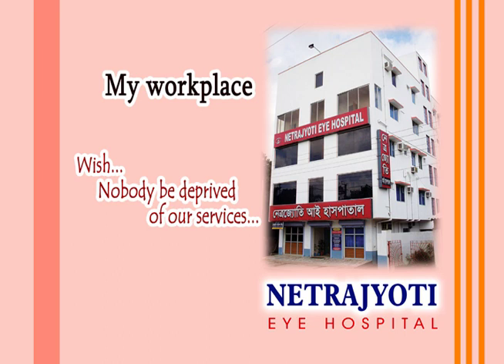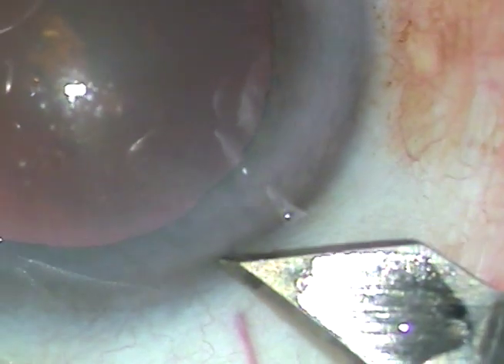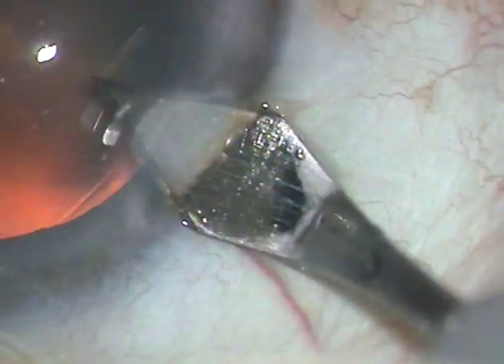Dear colleagues, in this video I want to share phacoemulsification of a soft cataract. This is the main incision — a 2.8 millimeter incision made with a steel keratome.